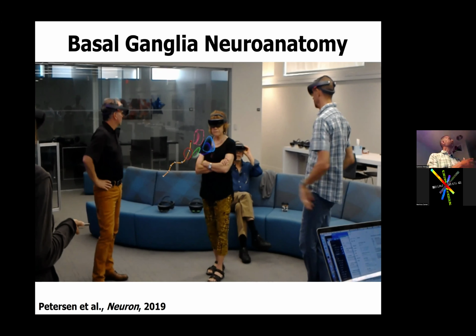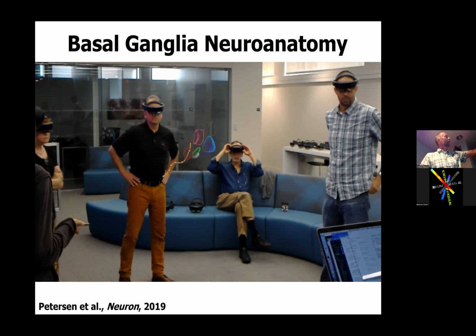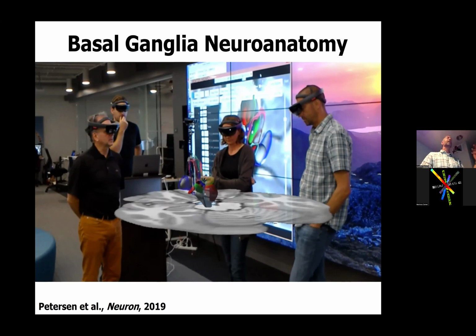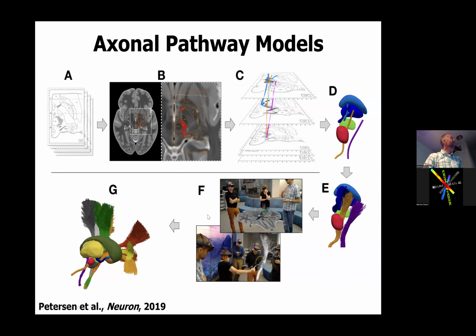And so this was my response to it: those little dots, right? Those dots on the orange line, we know they are waypoints along the trajectory of where these things should be, based off of old school histology slices that had come from human cadaver studies, for example, right? But up until this point, not many people had thought about overlaying these old school histology slices with modern human connectome brain atlases.